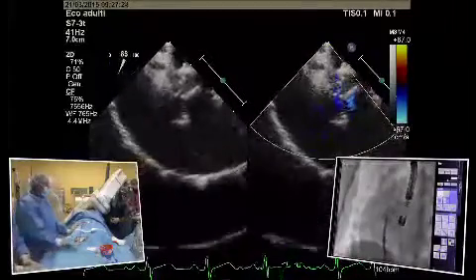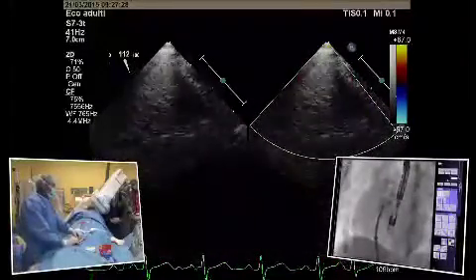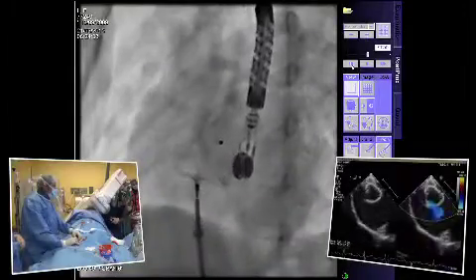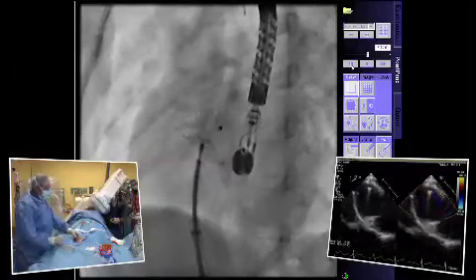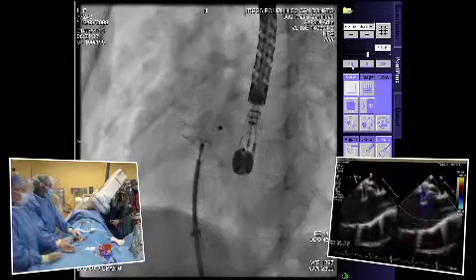It will straight once the device- see with the device there, with separation of the most anterior part of the disc. I'm pulling the device and on echo it's stable. Yes, it is. So if you agree, I think we are ready to release the device. Okay. Looks very good.